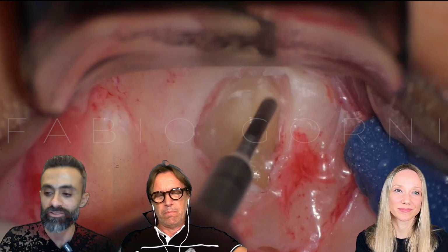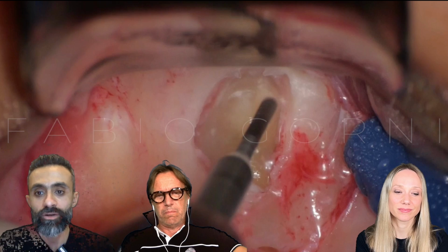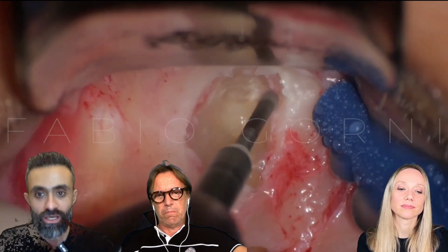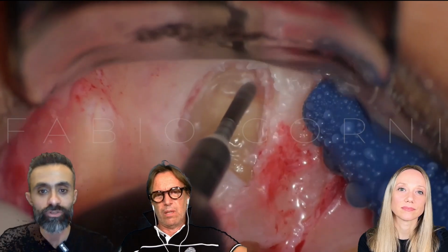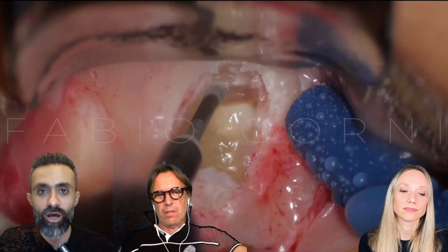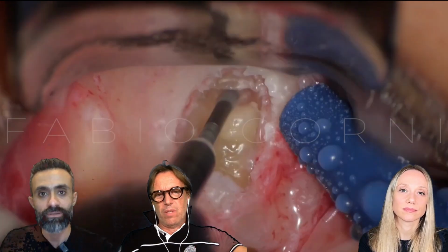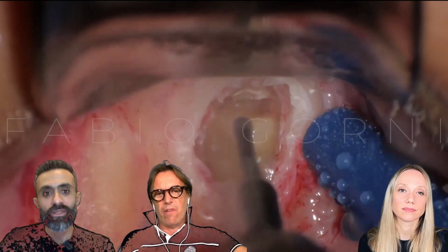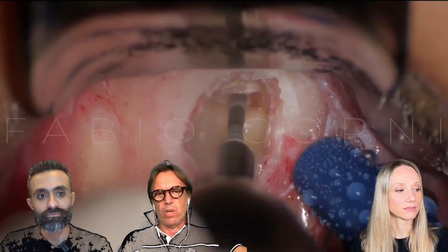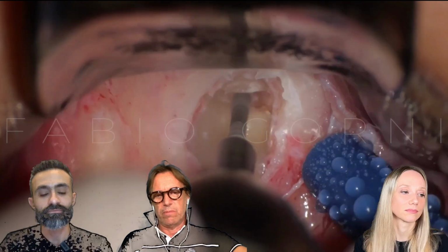That's clear and straight to the point. I know you always prefer the straight electric handpiece in posterior surgeries. Many of our audience would like to know why you prefer that. Maybe you can explain the ergonomics of using this type of handpiece. It's very simple, because only using the straight handpiece can you follow the action of the burrs.